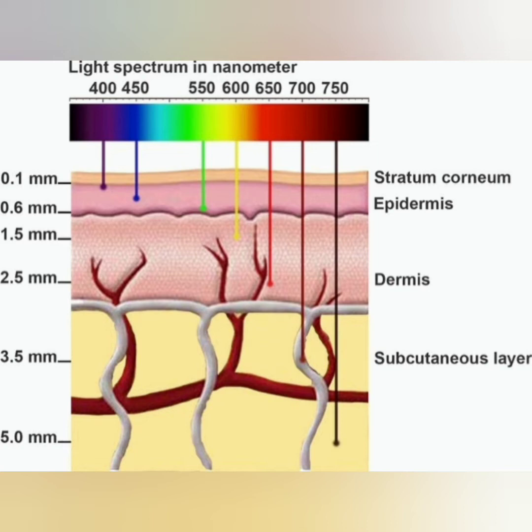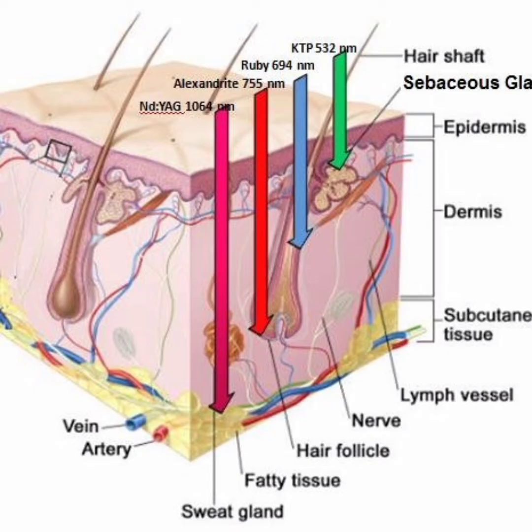Pulse light can be delivered in pulses or bursts of light varying from 1 pulse to 5 pulses at one time. So at the target you can deliver up to 1 to 5 pulses at one time, but the duration of each pulse and the delay time between the pulses has to be modified according to the treatment site. Longer durations are generally better for treating larger targets. Shorter pulse duration for smaller structures.